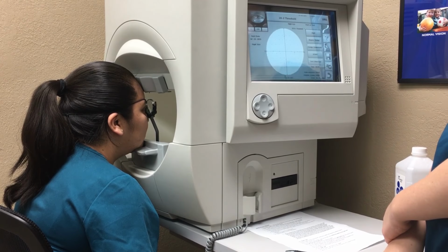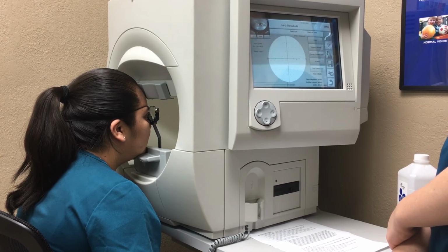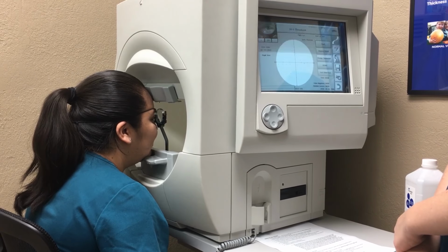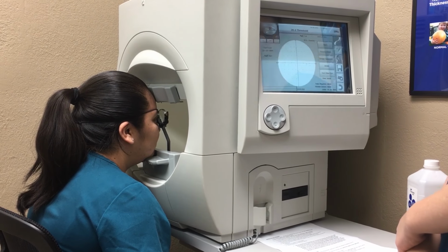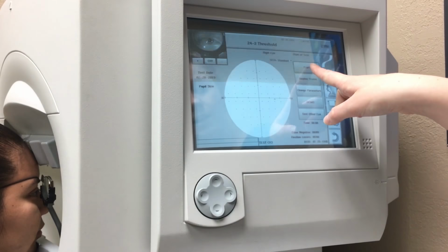You will not miss a light. Please let me know if you need to take a break. I will adjust your position throughout the test. Do you have any questions? No. Okay. Look straight ahead. We will begin by setting the tracking for your eye. Look straight ahead right now. And now I will click Start.